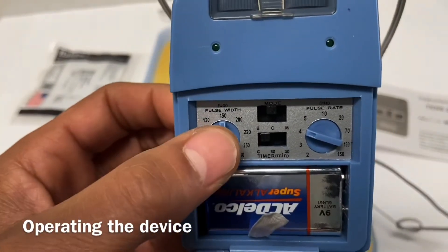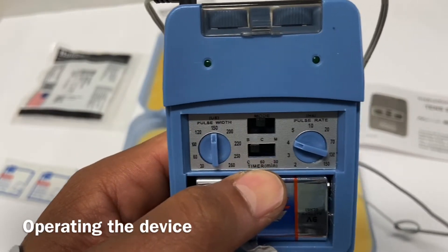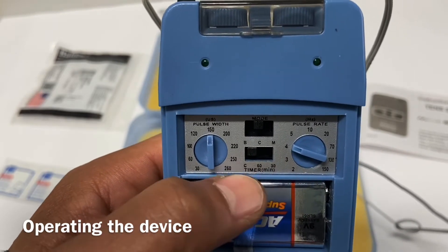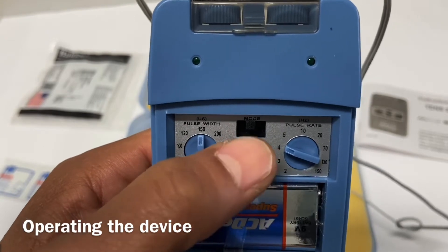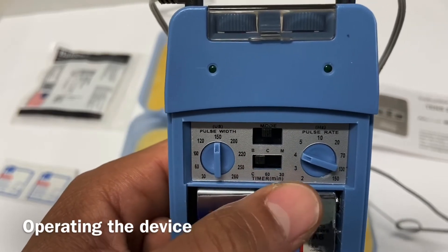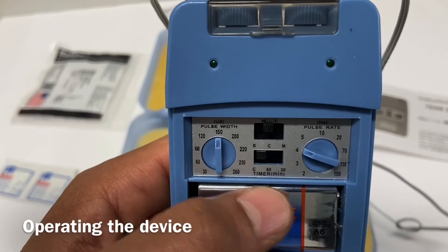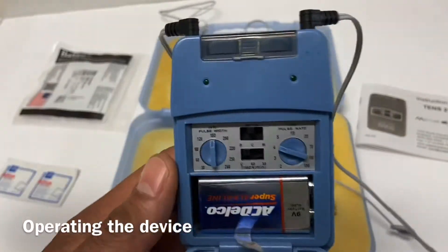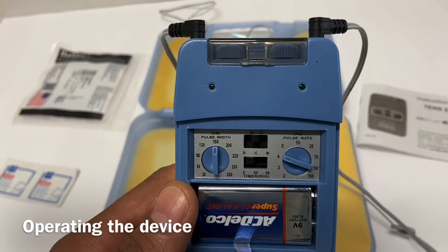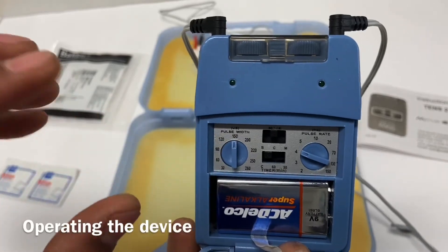The unit has pulse width, pulse rate, mode, and timer. The timer is straightforward — it can run on continuous, 60 minutes, or 30 minutes. In mode, you have B, C, and M — burst, continuous, and modulated. A continuous signal, a modulated signal where it's somewhat randomized, and a burst signal where it comes in small burst waves. More details are in your notes. Pulse width parameters — look those up in your notes to see what's used for different conditions like spasm or pain.